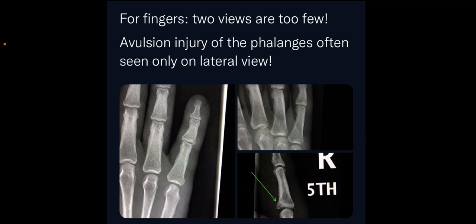The first is the AP view, the second is the oblique view shown topmost on the right side, and the bottom corner on the right side clearly shows the avulsion fracture demonstrated by the arrow. So to look for avulsion fractures of the phalanges, always try to take a lateral view if there is a strong clinical suspicion of a fracture.